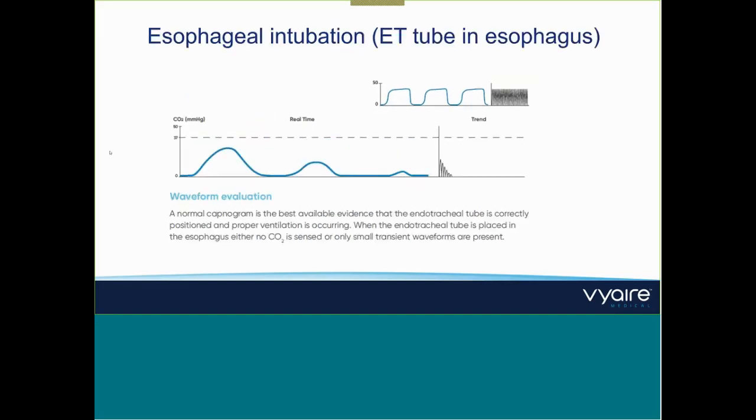And this is how it looks when you have done something wrong after intubation, or your intubation was not going on correctly. There might be a first breath where you get some CO2, but the second or third breath will go down to baseline, and then you immediately should know that something's wrong here, and the patient needs to be re-intubated. And I think that's quite obvious here.